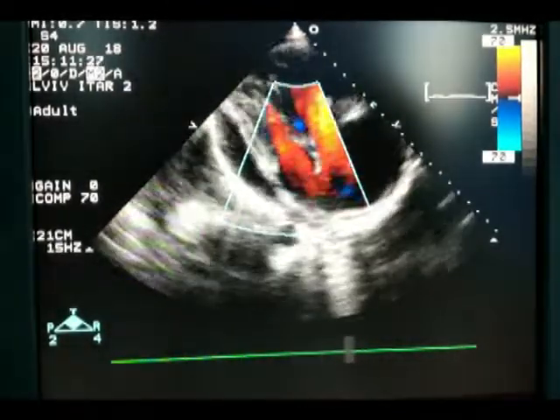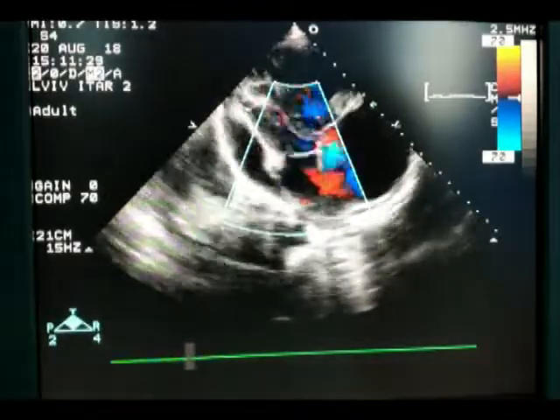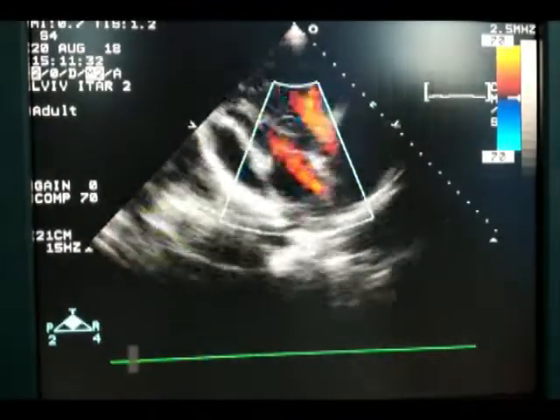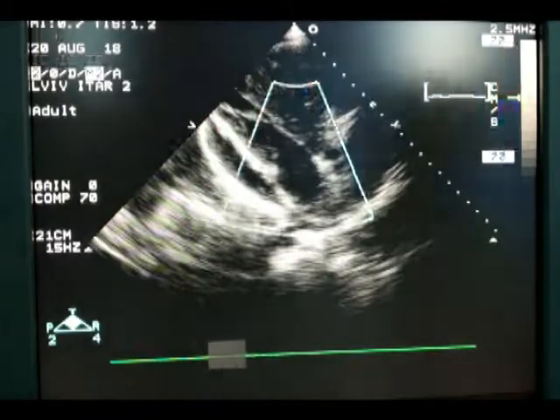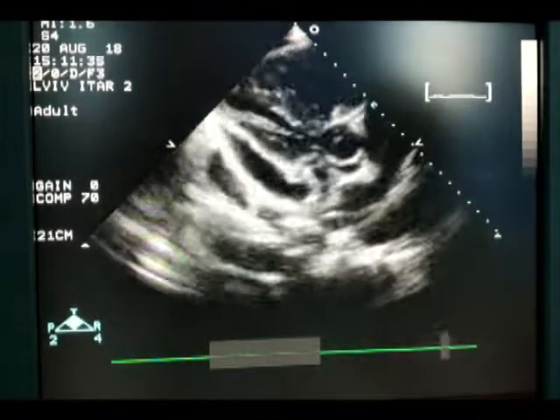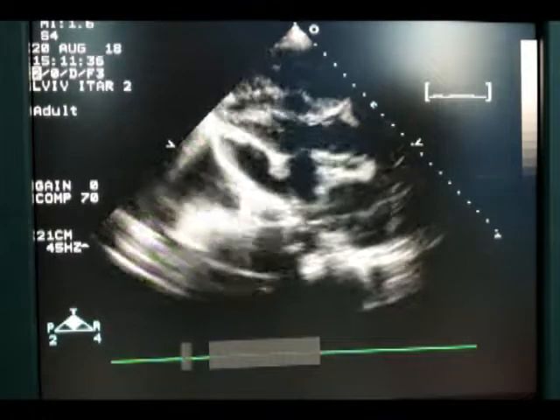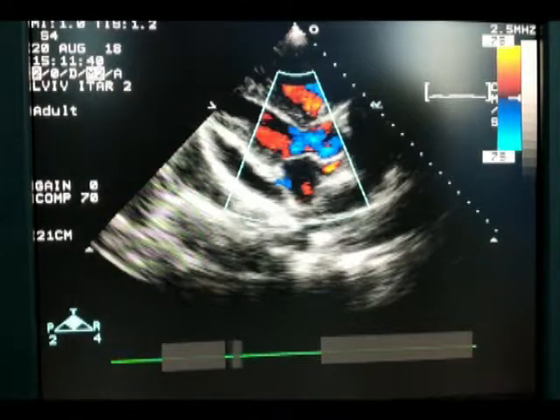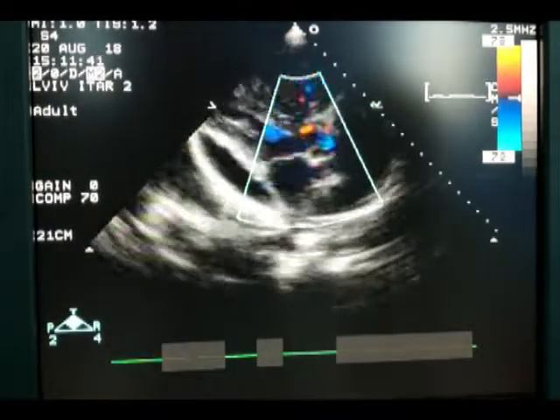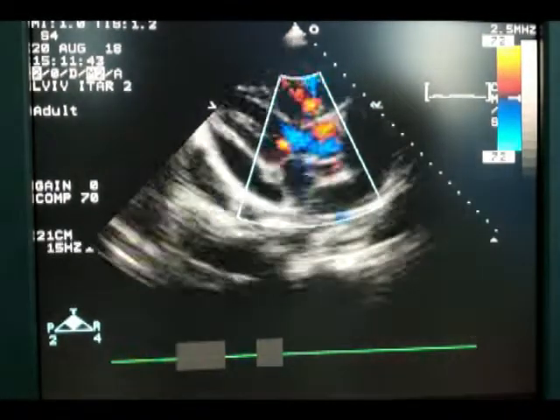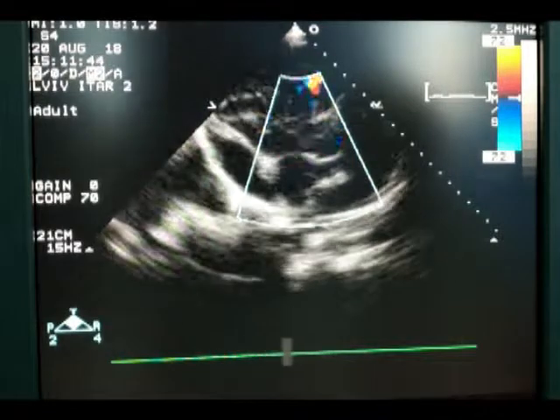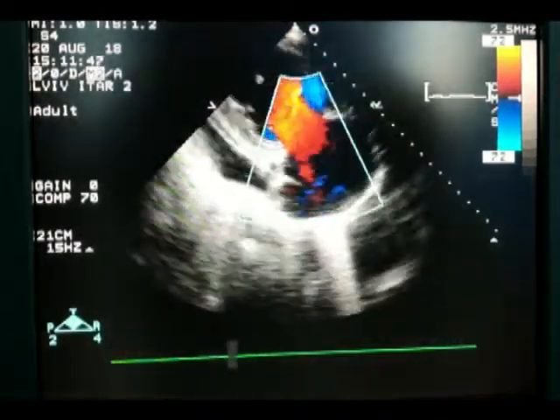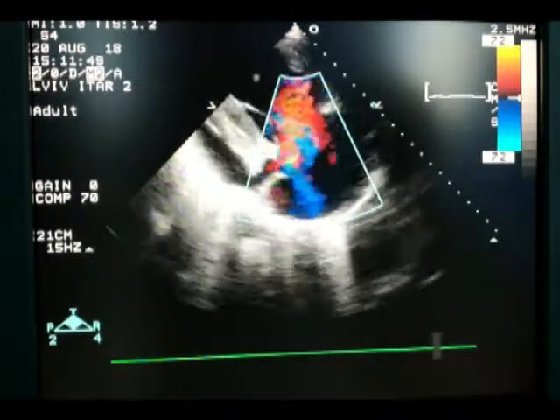The mitral valve in this patient is normal. Now we assess the aortic valve. The cusps of the aortic valve are normal. Now we use color Doppler and see normal laminar blood flow across the aortic valve. But we can see significant tricuspid regurgitation as a result of severe pulmonary hypertension.